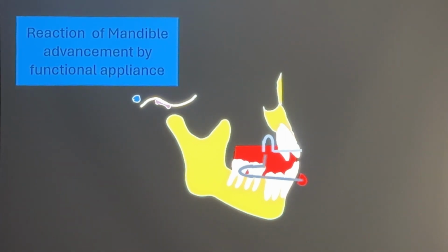So make the flat plane and then start 1 millimeter under the touch. The flat surface is the basic starting point, and then make one more thickness of grinding over there.